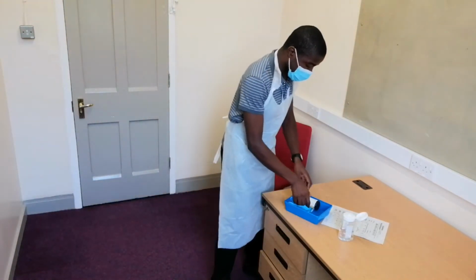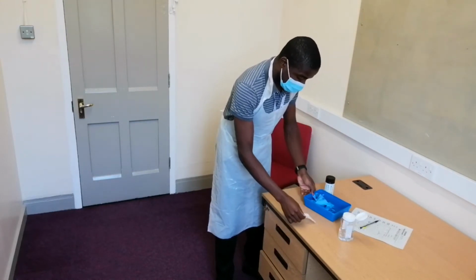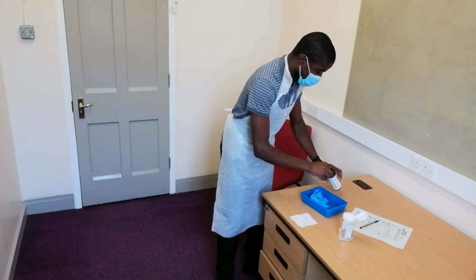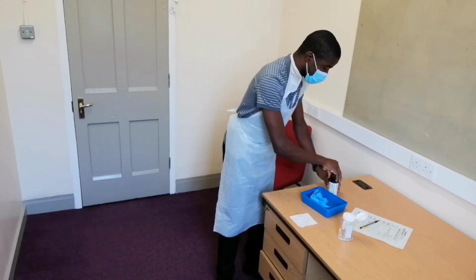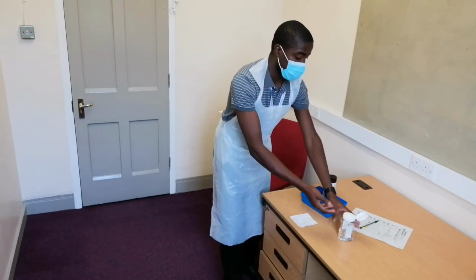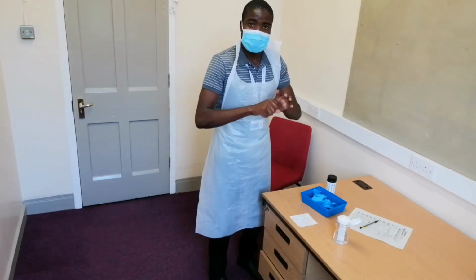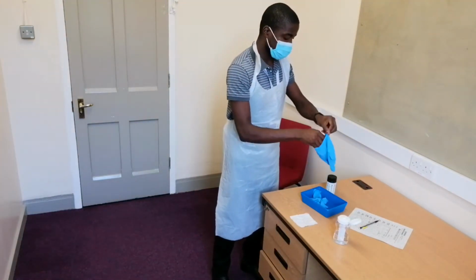And prepare my strip as I wait for the patient sample. I'll open my tissue and remove the strip without touching the inner portion and place it on the tissue. I do hand hygiene. Then I will put on the gloves.